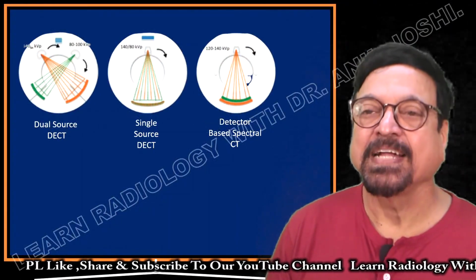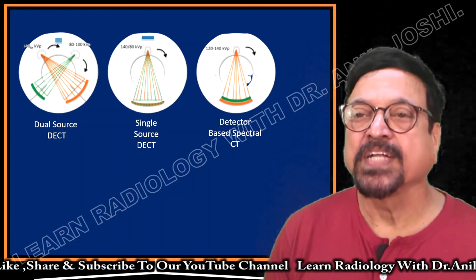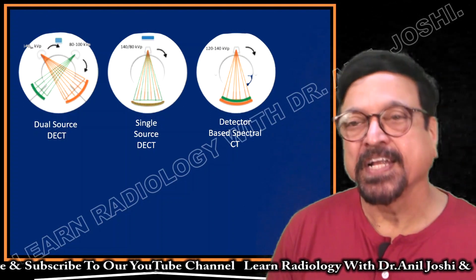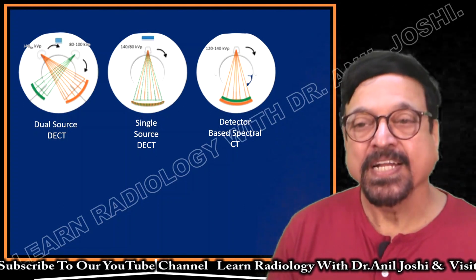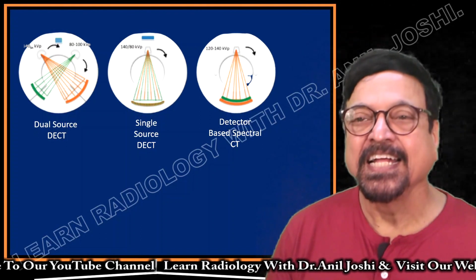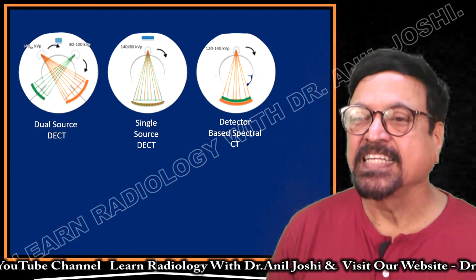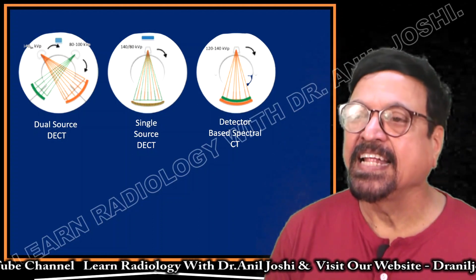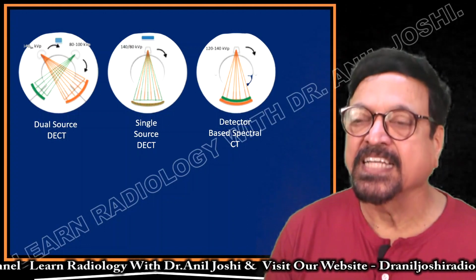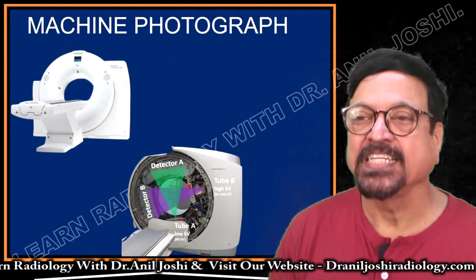Here we are seeing it diagrammatically. You can see two sets of tubes. One is rotating, the second is also rotating. Both are rotating with the detectors. Out of that, one is a normal tube and the second is a low energy tube, that is a dual source. Here we are showing in the first, second we can see a single source, and then we can see a detector based spectral CT. So these are the different types of CTs, of which we are seeing the advantages of dual energy.